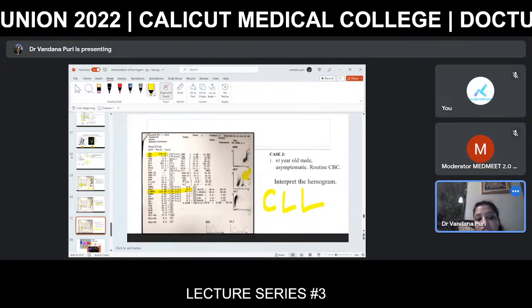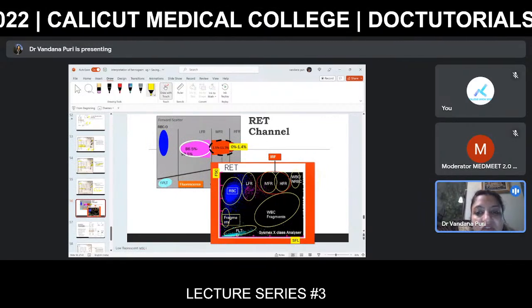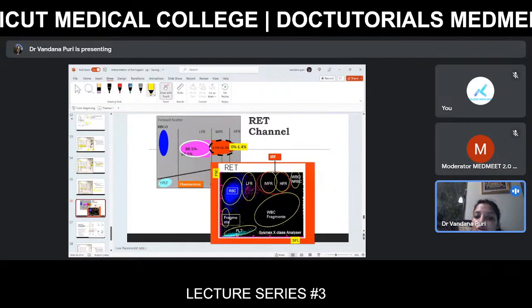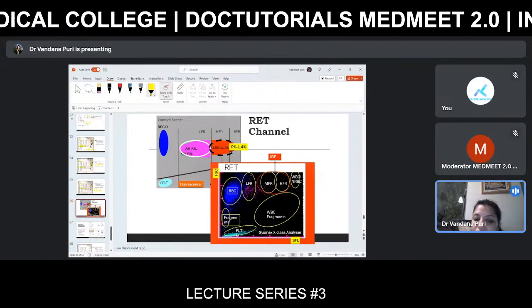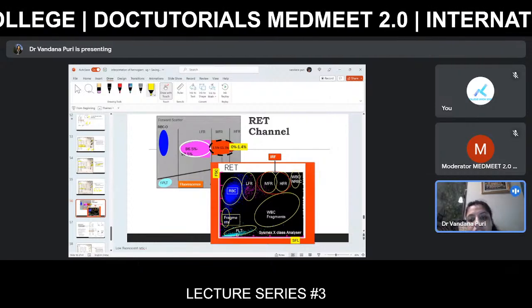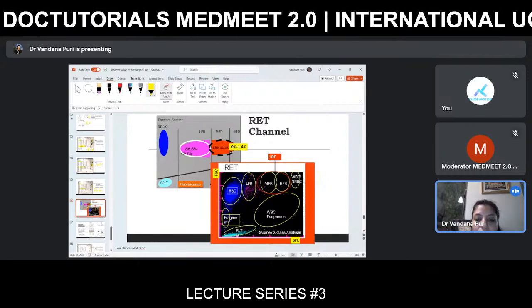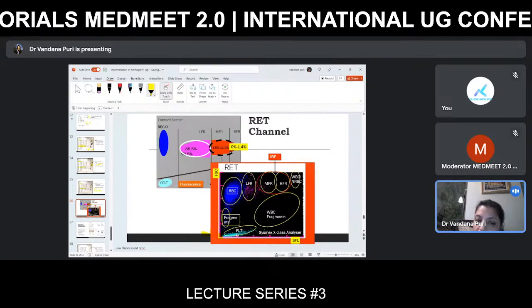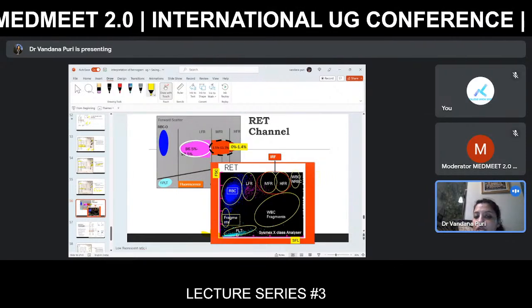Just to conclude, there's one more channel which I would like to tell you, the retic channel, because your talk is incomplete without the retic channel. When we talk about RBCs, we also should know about reticulocytes. And whenever reticulocytes are getting produced, apart from RBCs, we have LFR, MFR and HFR, that is low fluorescence, mid fluorescence and high fluorescence. So before your WBCs come, these fluorescence populations come in. These RBCs are differentiated from the platelets which come below, and in between the platelets and RBCs are some fragments. So this channel is called the reticulocyte channel.